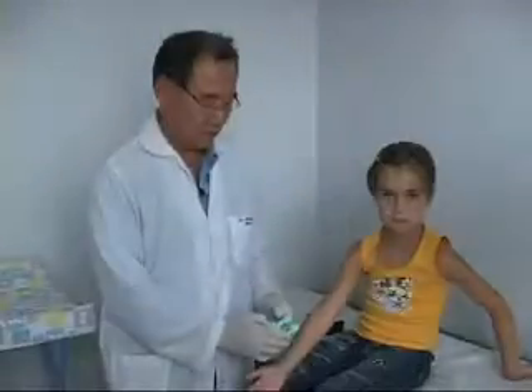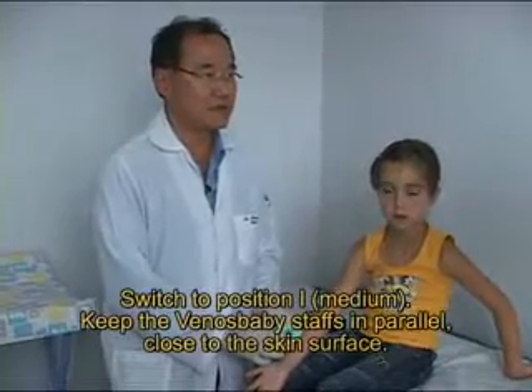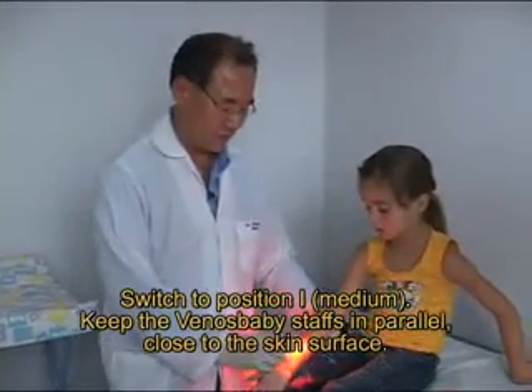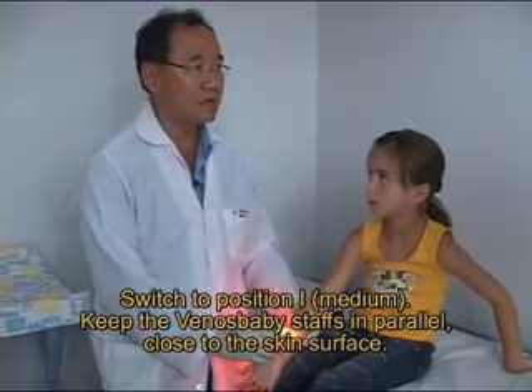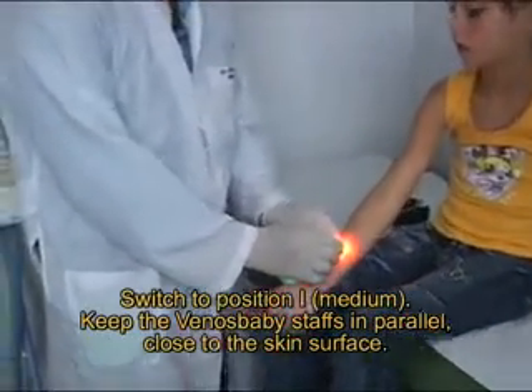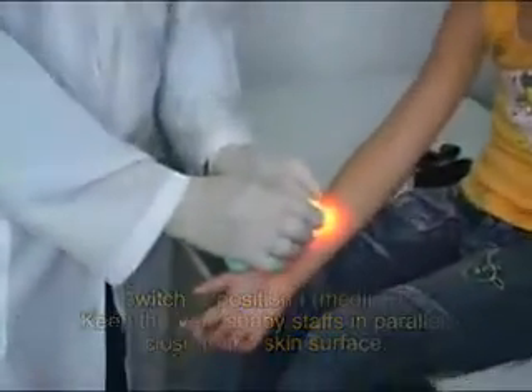You have to get the light down, whether under solar light or artificial light like this. Now go directly to the puncture area. Switch the position to medium intensity. Keep the VENOS BABY staffs in parallel and close to the skin surface.